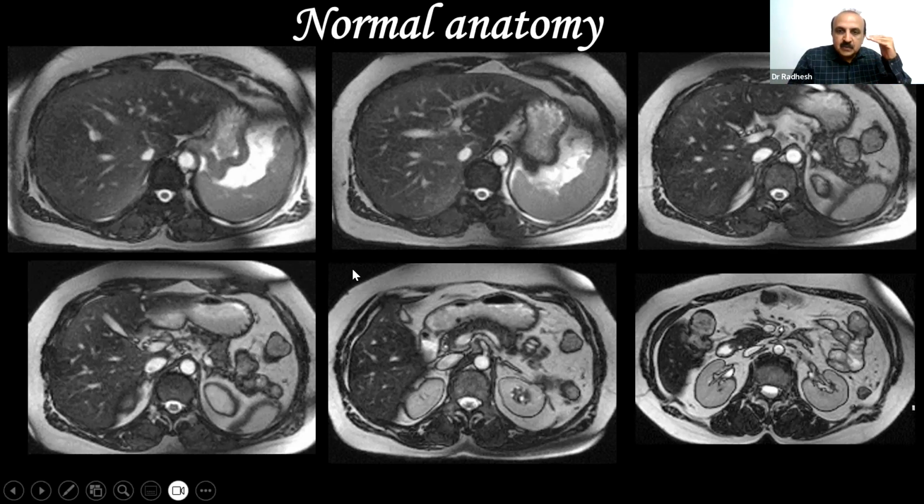Now you clinically know that this patient has portal venous thrombosis, but this patient is also in renal failure. Now we need to know, is there a tumor thrombus extending from the hepatic veins or the portal veins into the IVC, or has it come down into the SMV? So in such cases, we do this gradient echo sequence. These are very fast sequences. To acquire the whole liver, we need around 12 seconds. In one breath hold, the whole liver can be imaged. So this, we actually do as a routine.